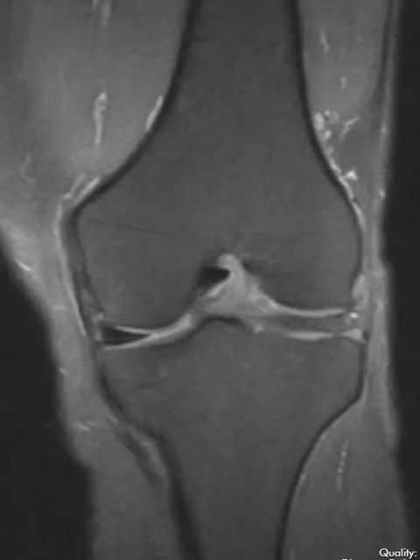So I'm going to show you a normal medial meniscus and show you what the lateral meniscus, which is abnormal, looks like. This is the medial meniscus. This round thing here is the femoral condyle — the femur. This big bone here is the femur.